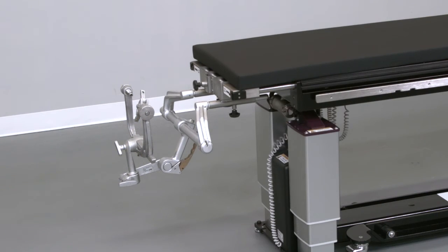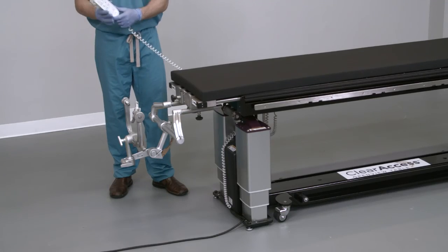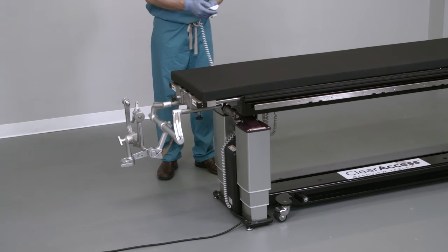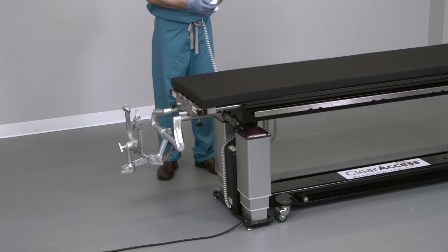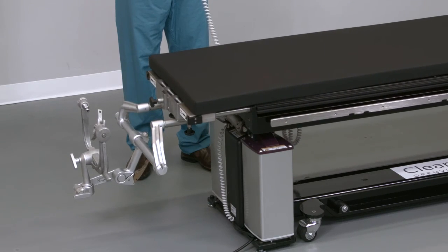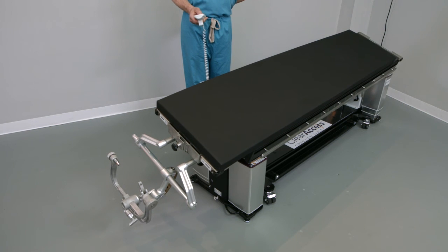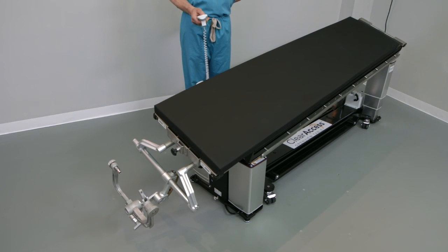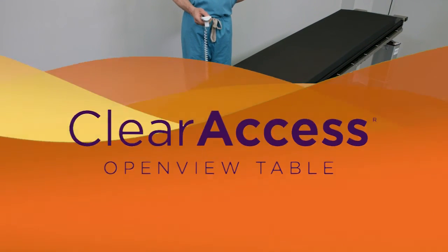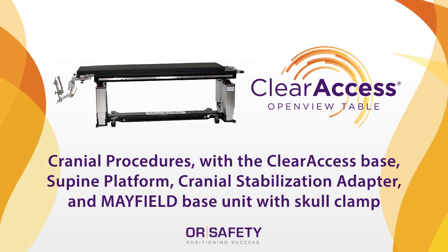The table is equipped with two identical hand controls. If desired, one hand control can be draped and placed in the sterile field, allowing the surgeon to manipulate the patient and optimize the surgical approach angle. The table can be lowered to 22 inches of height, which could allow the surgeon to be seated during the procedure. Up to 20 degrees of lateral roll left and right, 12 degrees of Trendelenburg and reverse Trendelenburg, and combinations of both facilitate visualization. When extreme angulation is employed, it is critical to adequately secure the patient to the table. Please consult the Clear Access instructions for use with any further questions.